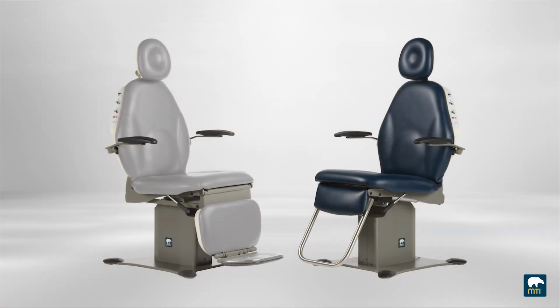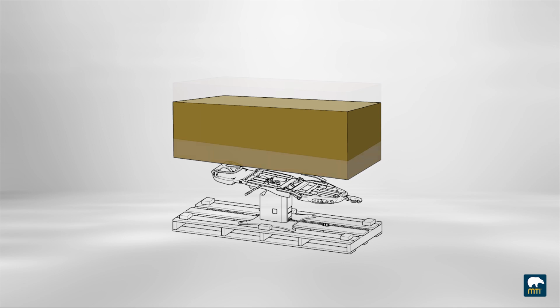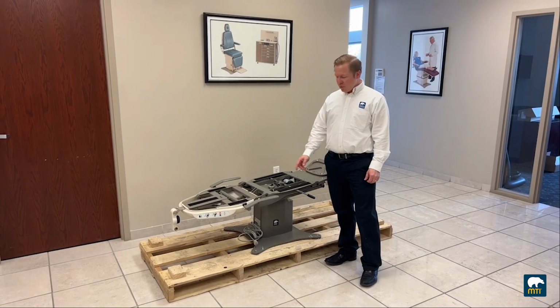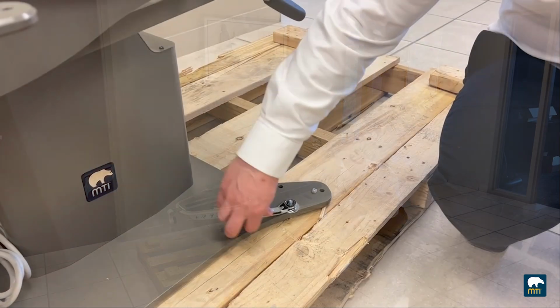For this installation, you'll need a screwdriver, a wrench, and a knife or scissors. The MTI 461 and 403 models will come in a box attached to a pallet. First, remove the outer straps and lift the lid off. Now that you remove the box and the packaging material, the next step is to remove the 4 bolts on each corner of the chair using a wrench.